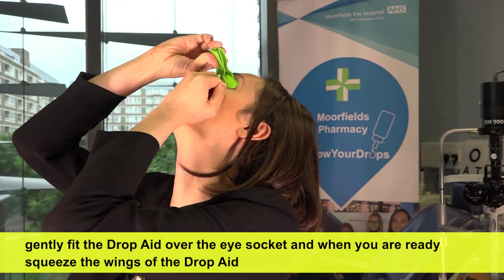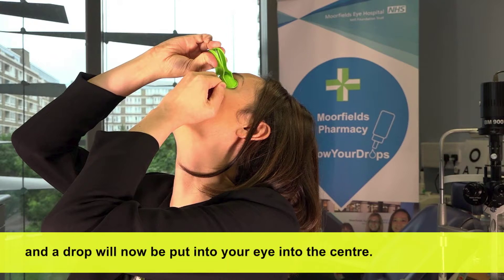And when you're ready, squeeze the wings of the DropAid and a drop will now be put into your eye into the center.